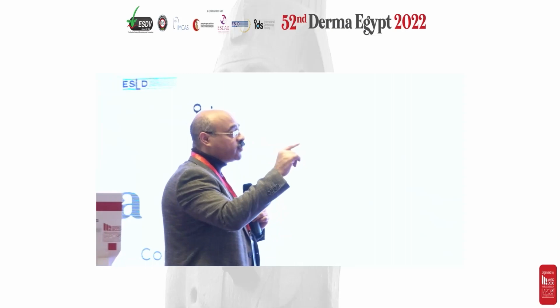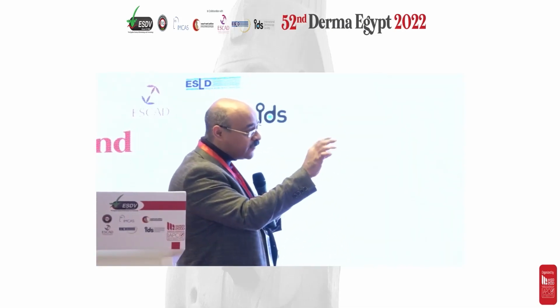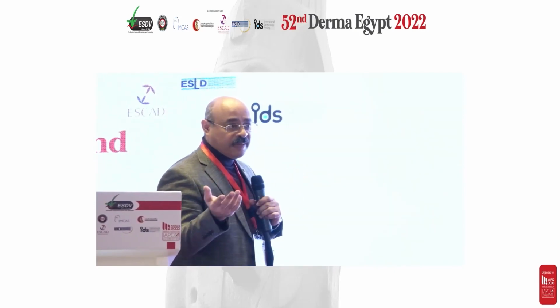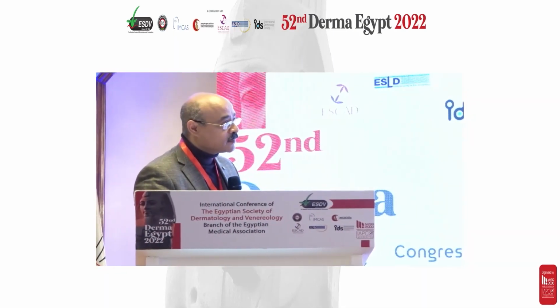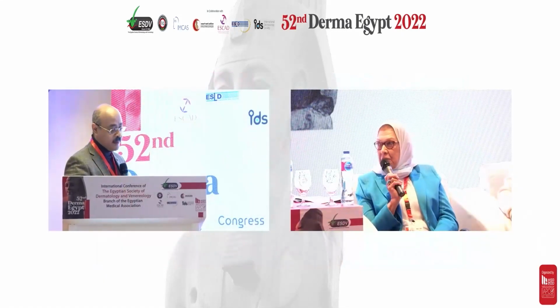And this is the advantage of the microneedling radiofrequency over the laser, because with the laser we have risk of hyperpigmentation. But with microneedling radiofrequency, it is non-ablative, there is no downtime, and it's working really very well. I think this was the last. The effect of ablative is more acceptable. Of course, but for fear of hyperpigmentation, we don't use it.